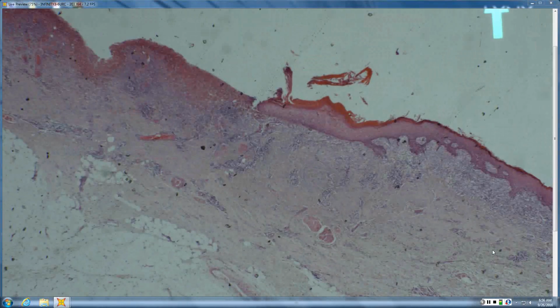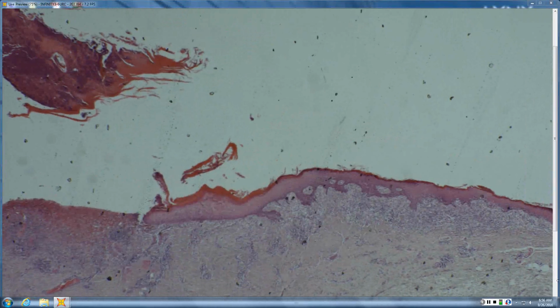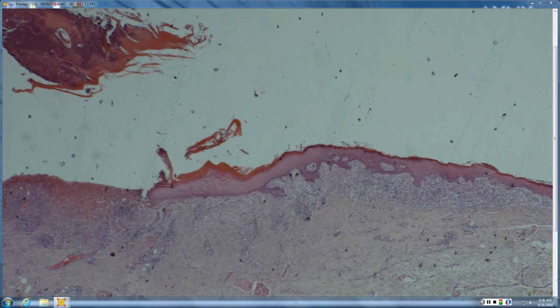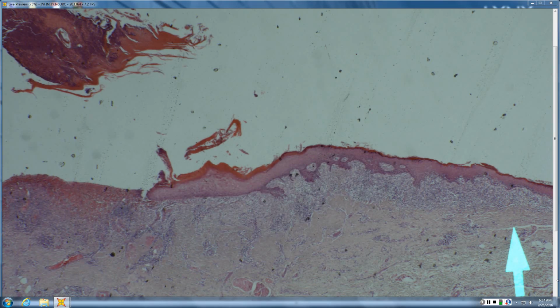Okay. So this one is mycosis fungoides, and it's in this chapter because it can certainly look very psoriasiform. Now this cut does not necessarily look very psoriasiform, and in fact you have this huge ulcer over here, and that doesn't necessarily make sense for psoriasis. Psoriasis shouldn't really be ulcerated per se. Over here you can kind of imagine maybe there's some acanthosis going on, so we'll just play along and say this is psoriasiform. But what is odd is that underneath there is this lichenoid band of inflammation, which we went through the prototypic psoriasis case, and that should not be seen in psoriasis.